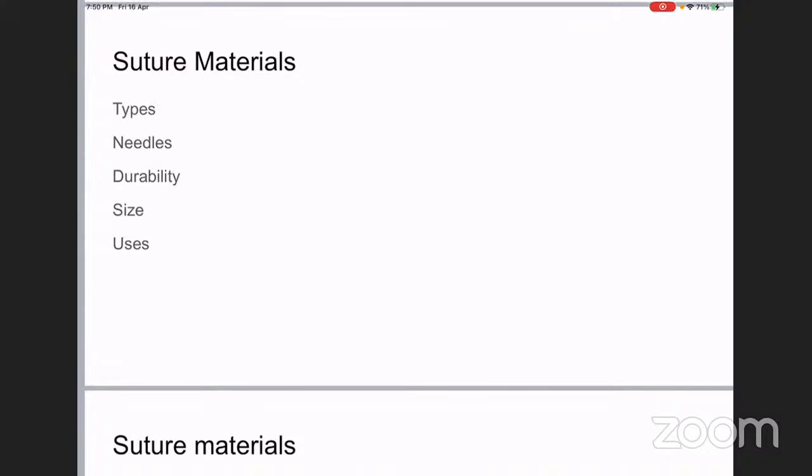And then we also have catgut. So what is catgut derived from? Anybody in the audience? Do you get it from cats? Anybody? Sheep gut mucosa, ma'am. Yeah. So you get it from the submucosa of the gut of the sheep. So that is catgut. Again, that is another natural origin suture material.